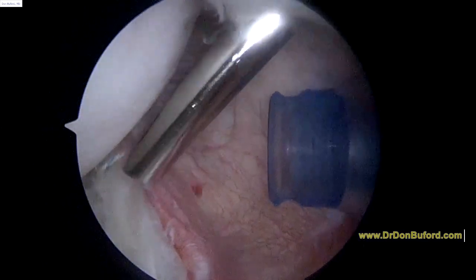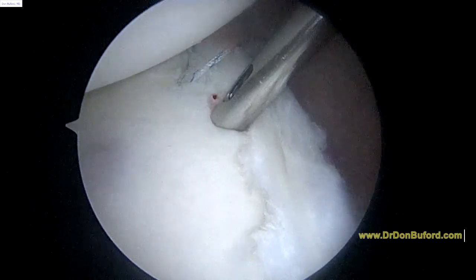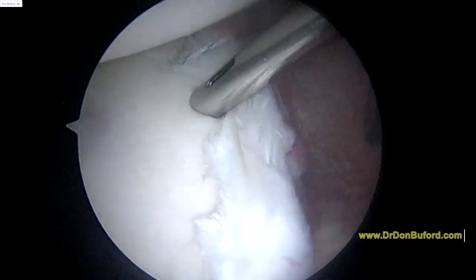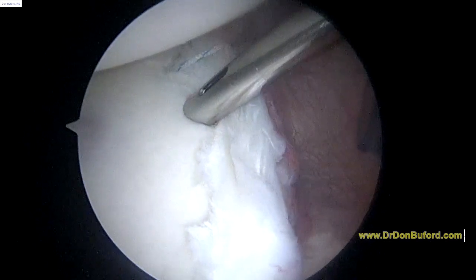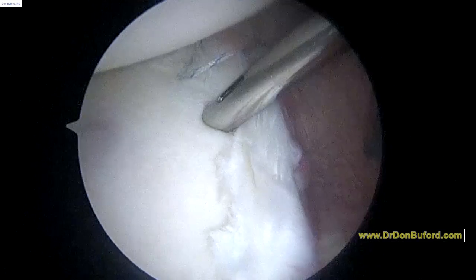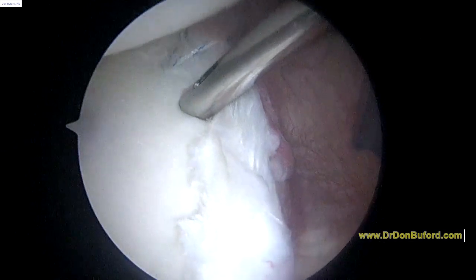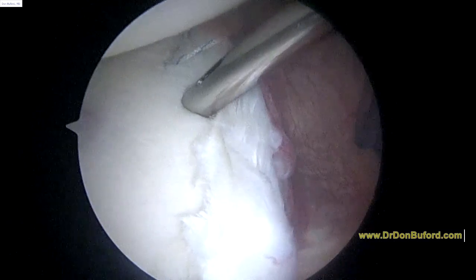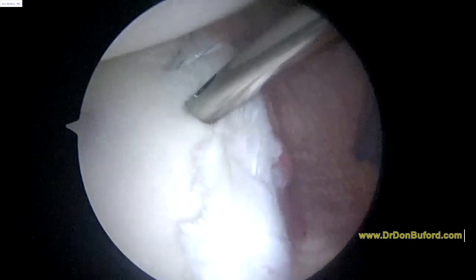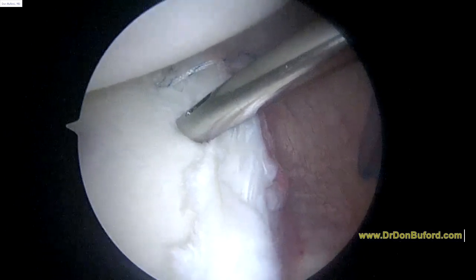Okay. Pull that. Anchor? Or drill, I'm sorry. We're going to place another anchor right about here. So into that hole, we're going to pass our suture anchor. And once we have that buried, we can unload the inserter. And you'll see we've got two more sutures to work with.